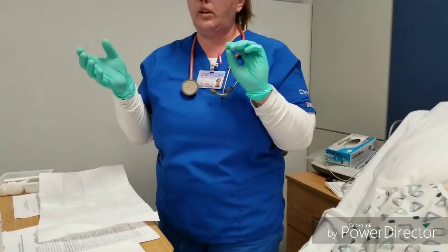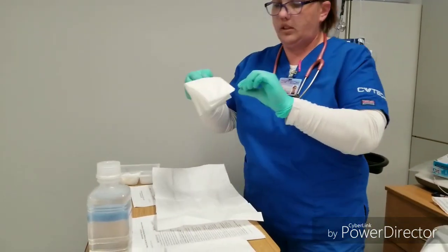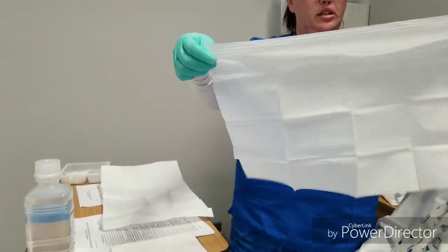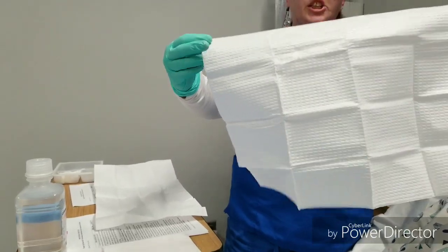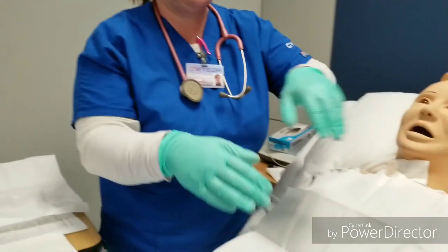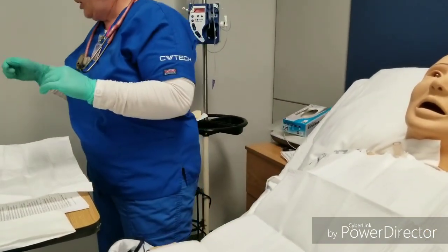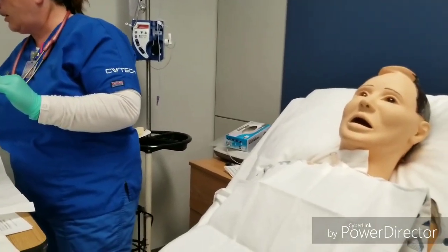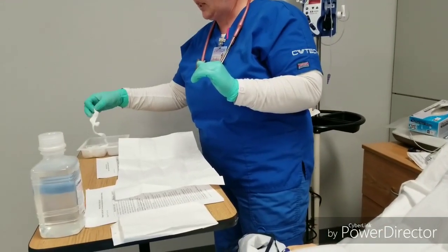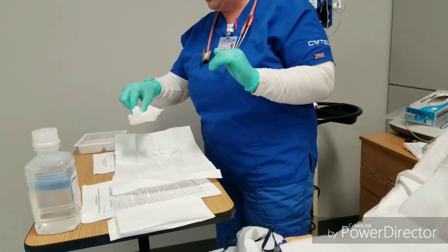I'm going to have 1 sterile hand, 1 dirty hand again. This is the dressing, or the drape, I should say. And there's a shiny side and a dull side. You want the shiny side down because that provides the moisture resistance to keep your patient's clothes clean and dry. Your kit comes with some cotton swabs, some pipe cleaners, and new trach ties. Take these out, drop, drop.